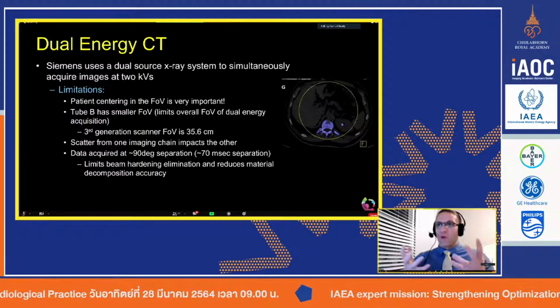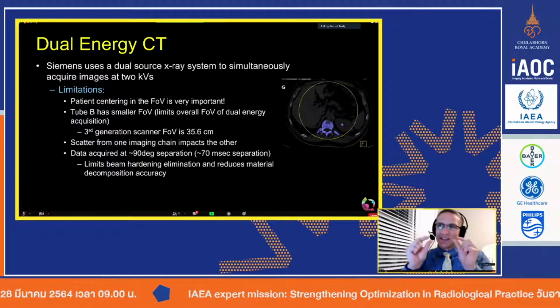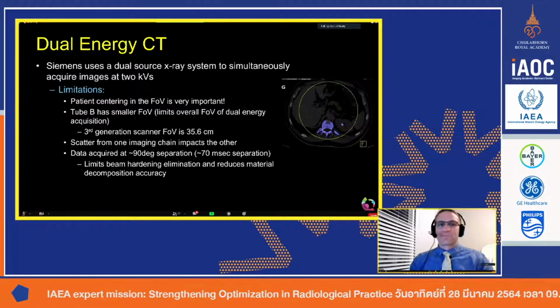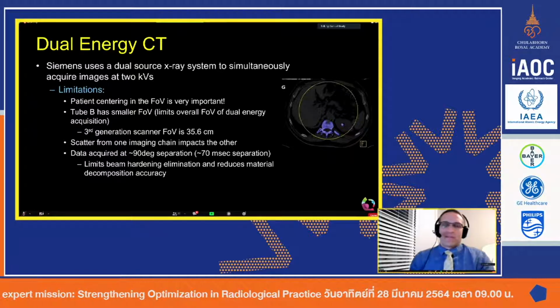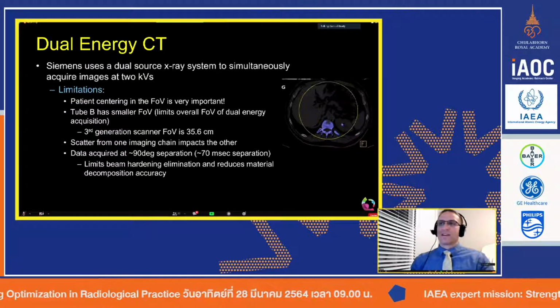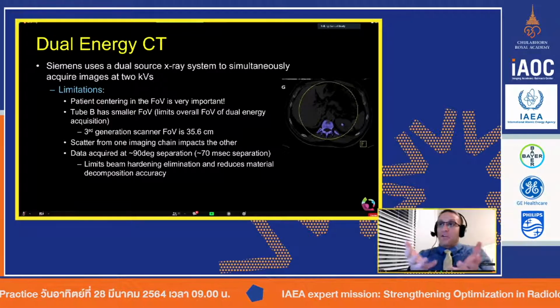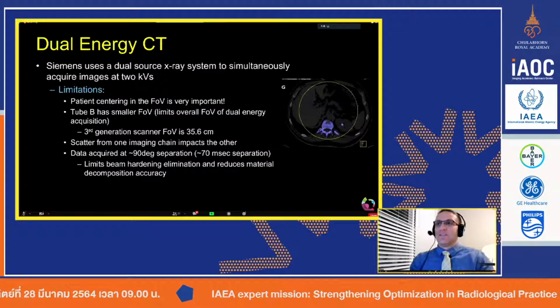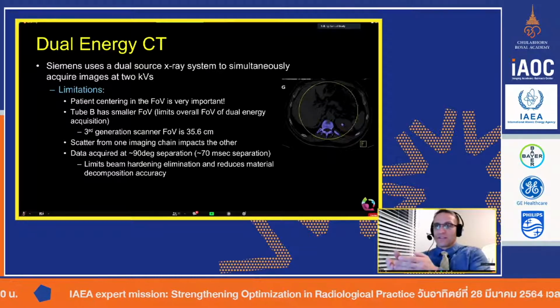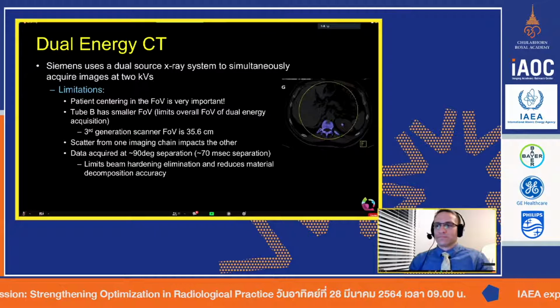And if you really want that diagnostic information from dual energy, then is just a little bit extra radiation worth it? The answer is yes. Up to this point, people have been using dual energy for the last 10, 15 years, and they always said they would justify the extra radiation dose because look at all the extra information we're getting. If that extra information is vital for the clinical answer or the clinical task, then yes, the radiation dose is worth it.